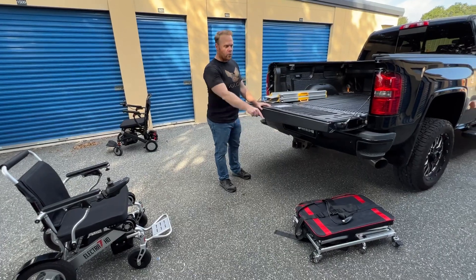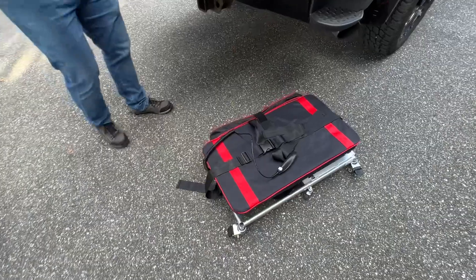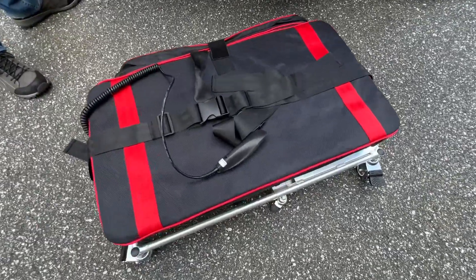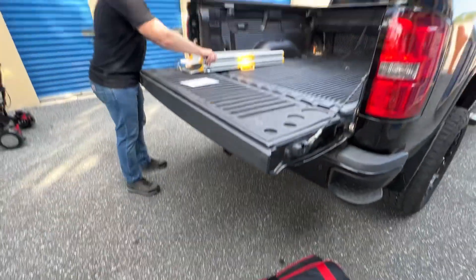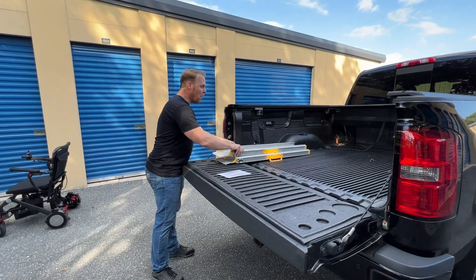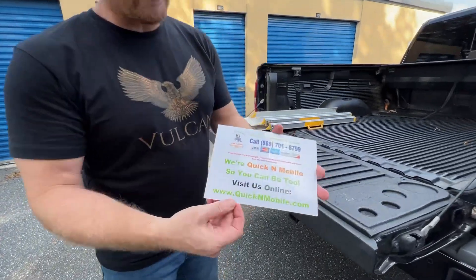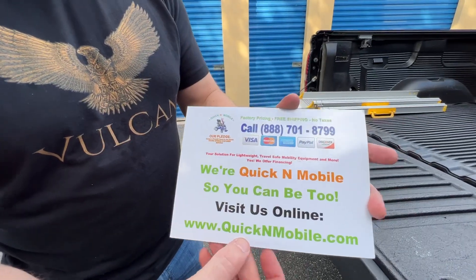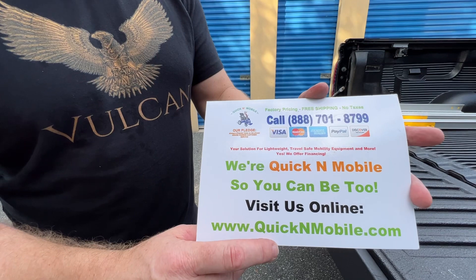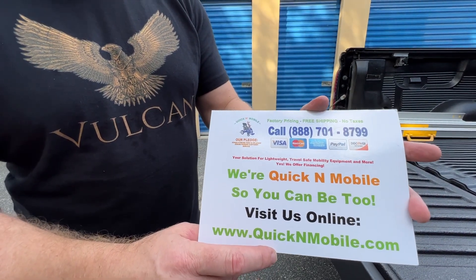First, we're going to show you the Vulcan lift. This Vulcan lift weighs just 24 pounds and it lifts up to 110 pounds. Then we are going to use a ramp system to load the Electra 7. Before we start, great opportunity to pause the video to learn where to find us online — QuickNMobile.com. You can find a lot more information about the Electra 7, the Vulcan, and many other chairs as well.